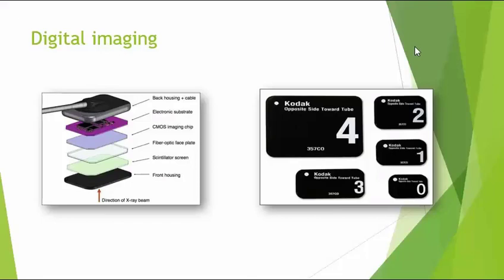Digital imaging uses the same procedure as plain radiograph, but instead of the normal film we will use special sensors. These sensors can be wired or wireless. The image is then transferred to the computer, whereby a software program will enhance and process the image. Digital imaging gives the same value as plain radiograph, but with certain advantages. We will find out in the next slide.